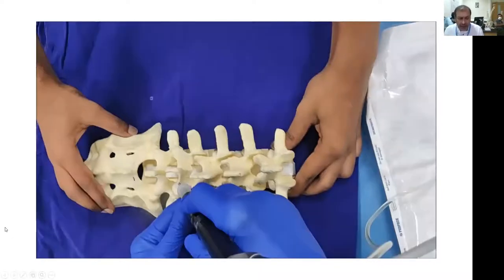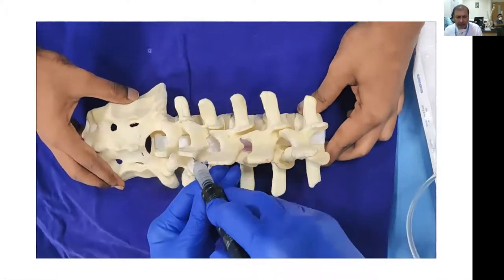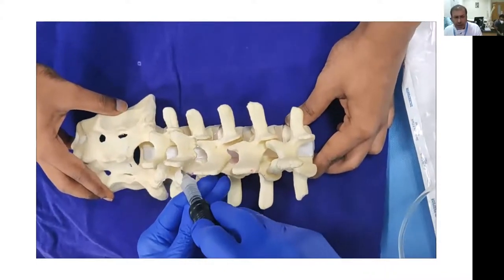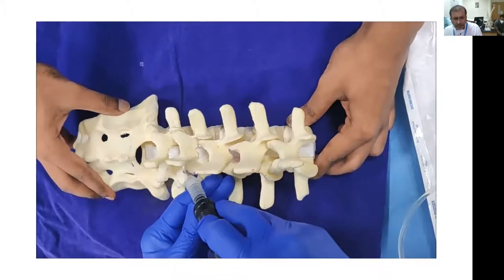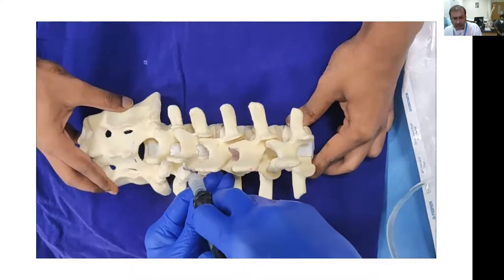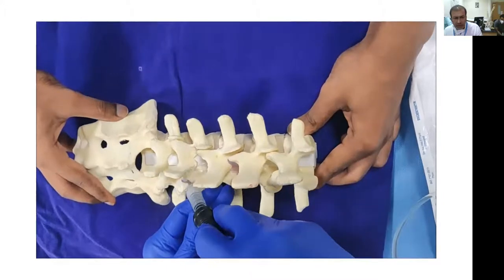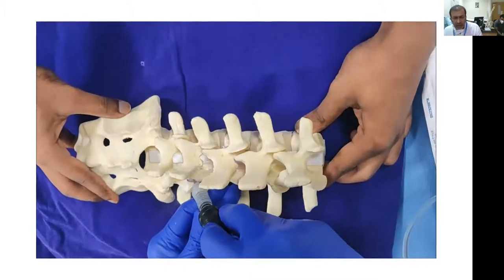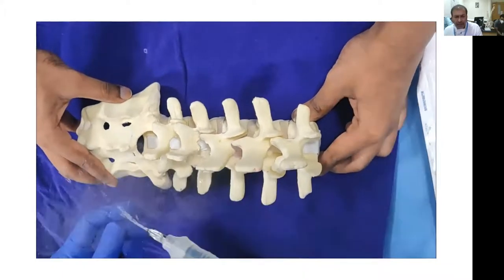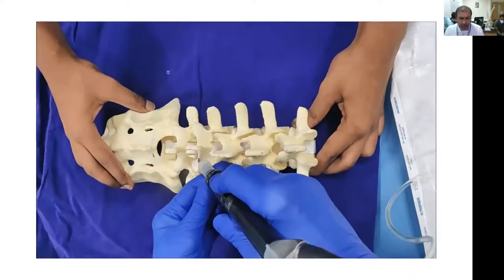And these are the typical osteotomies that we perform. So one is to remove the facet. That is osteotomy number one. And once you have done that and the facet comes loose, again, as you know, when you do this, you have a lot of bone that you can use for graft. And then this is osteotomy number two.